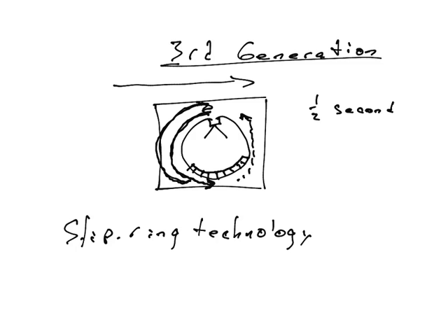The reason is because, obviously, this machine is wired. You have power cables going through it. You've got the data cables coming out of the detectors and so forth.